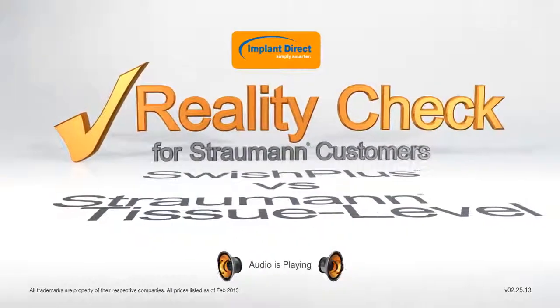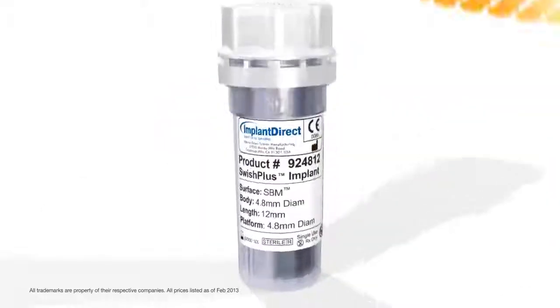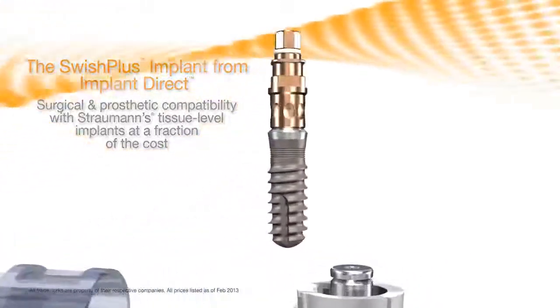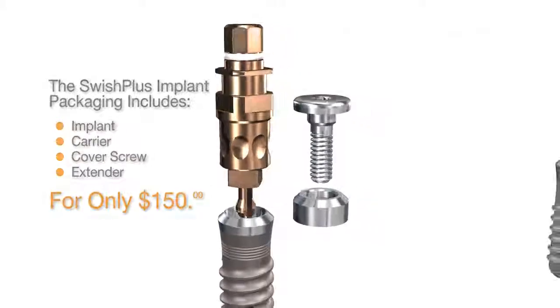The Swish Plus implant, with both surgical and prosthetic compatibility to the Straumann ITI tissue level implant, provides a reality check to Straumann customers by providing an improved design and packaging at a fraction of the cost. The Swish Plus includes a cover screw and a 2mm healing collar.